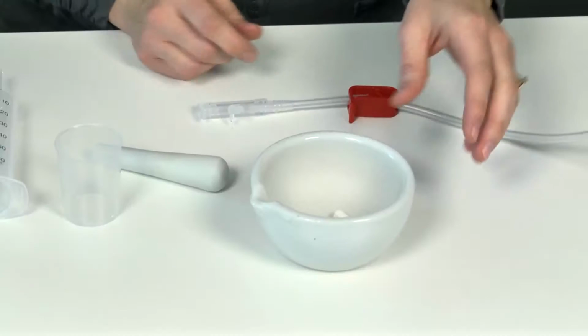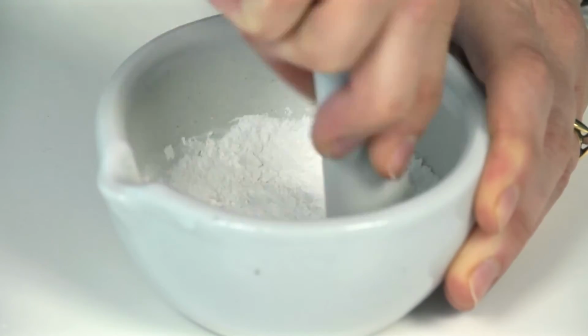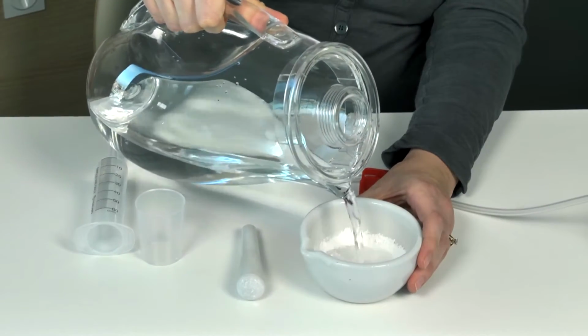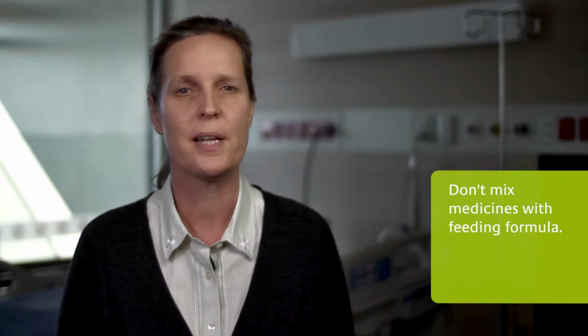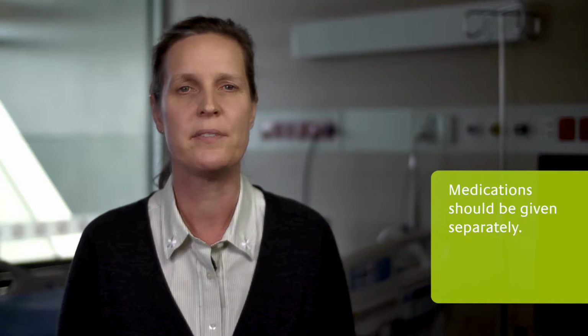Medicine should be in a liquid form if possible. If your medical team has told you that your medication can be crushed, make sure you crush them well and mix with water to make a soup-like mixture. Do not mix medicine with the feeding formula. Do not mix medicines together. Each medication should be given separately.